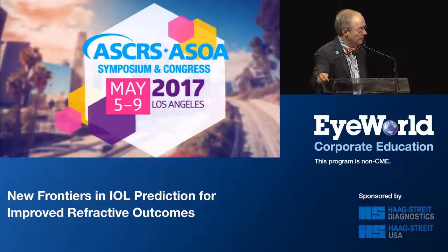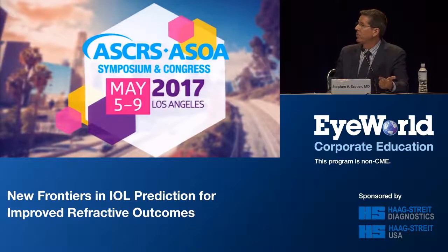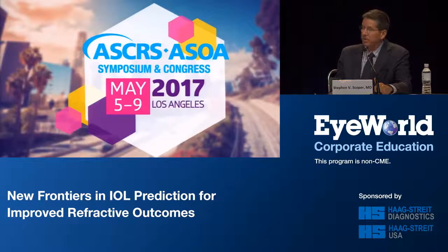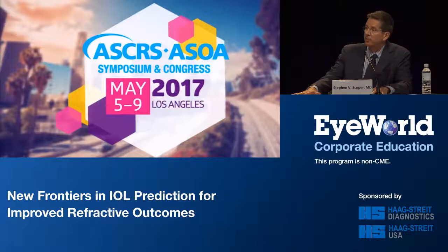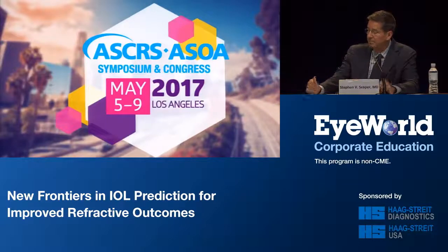So our routine is all the measurements are done before the patient sees the doctor, and I use the Lenstar, it's an OPD, and then we use a Cassini as well, looking at the posterior corneal astigmatism. So I'll look at those three. Now, if there's any discrepancy, sometimes I'll send them back for other instruments, other testing, but those are the three basic things that go for every patient before they see me.